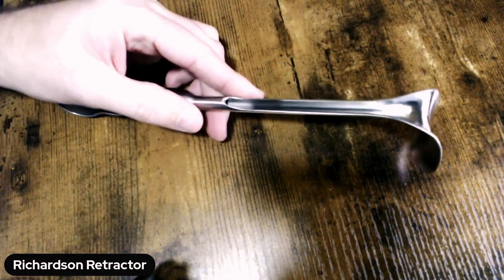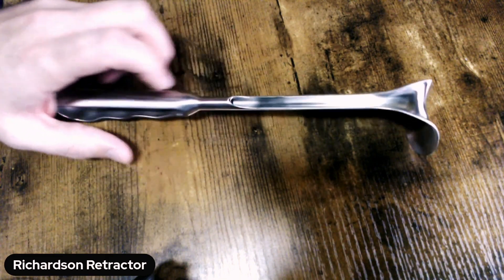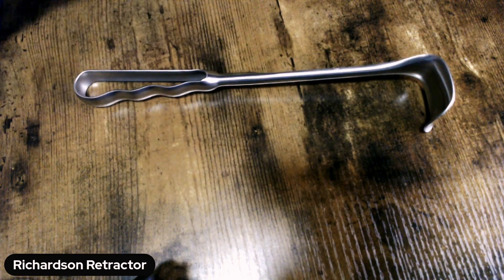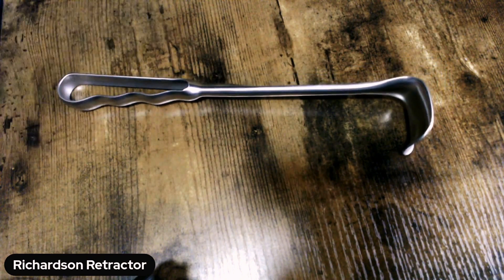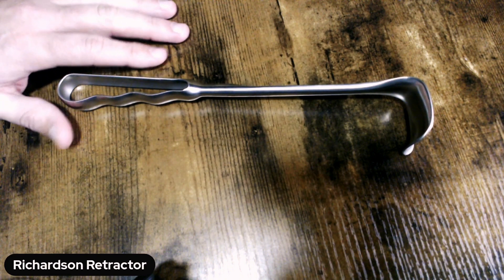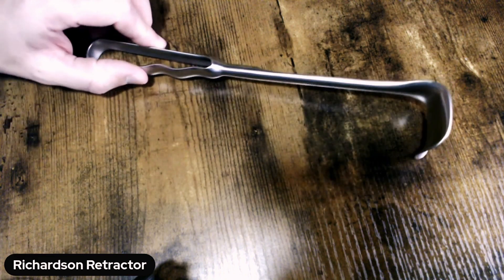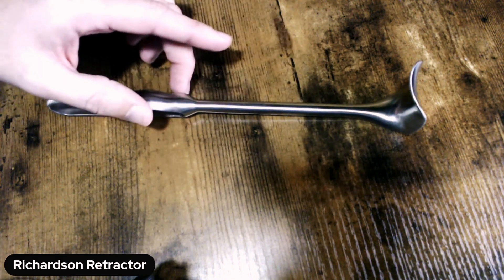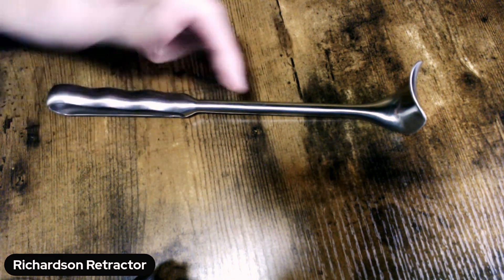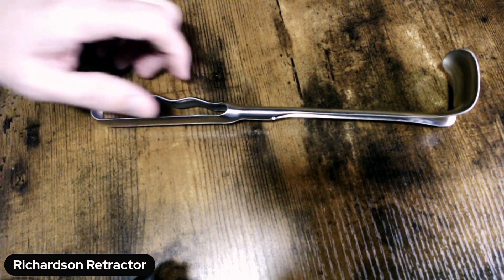What's important to know about that tube — or that cannula-like lumen — is that it is a perfect hiding ground for residual debris. So it's very important in the manual cleaning stage, number one, to identify what it is you've got in front of you, and number two, be aware of the potential for debris hiding in there. On the clean side, that's the last line of defense, so do your due diligence to examine inside that hollow handle.